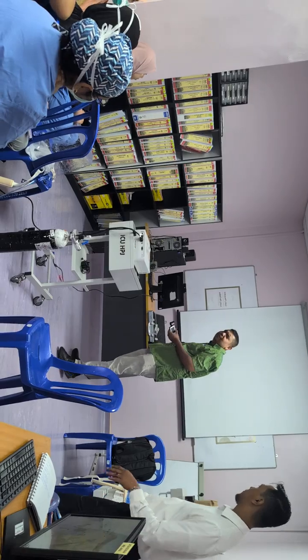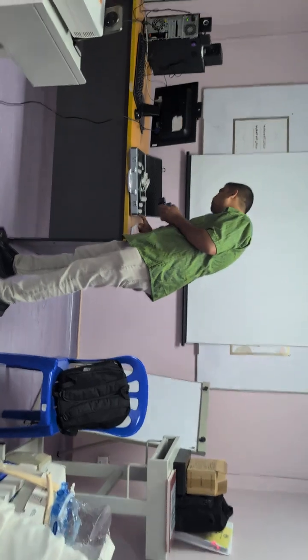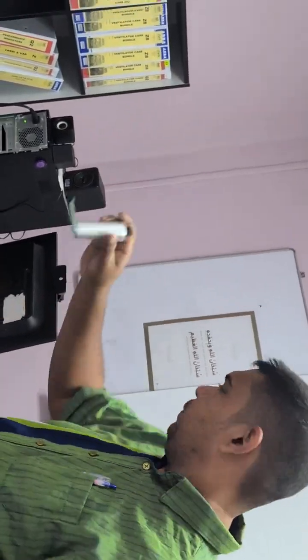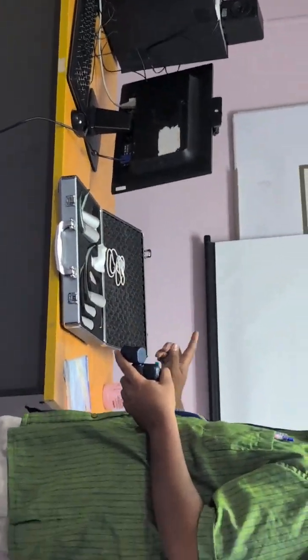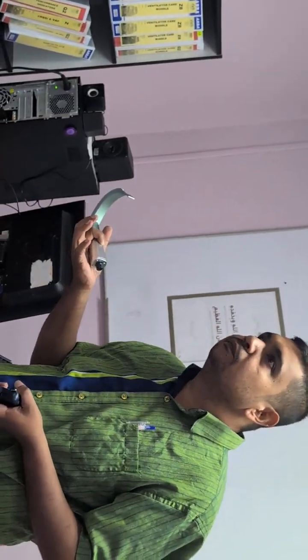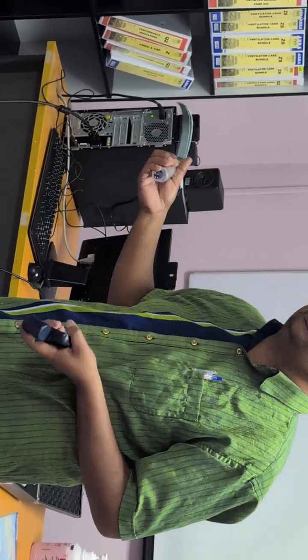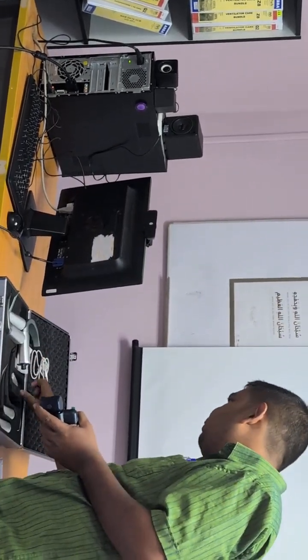So I'm going to tell you what everybody tells you, but in a different way. This has got all the sizes, the smallest being Miller 0. I do not have a 00, but I have a 0. And then I have a 1 all the way to a 4, and I have a D. Now, usually a D would require a special stylet. This does not require a special stylet. You can use your own stylet. I've tested it in Sungai Petani, it worked well. Now, what I'm going to show you and teach you today is this.